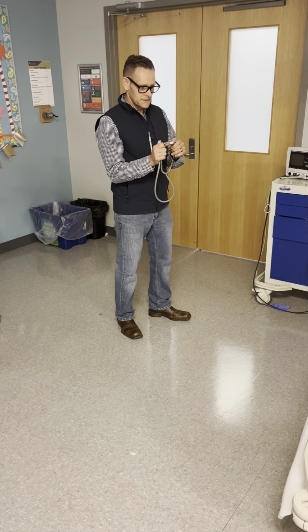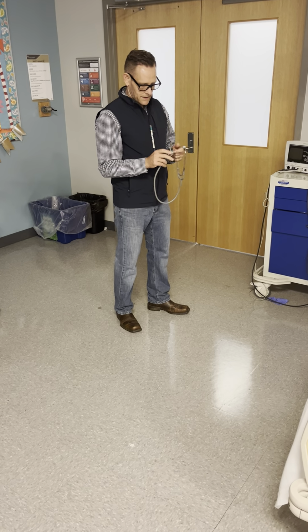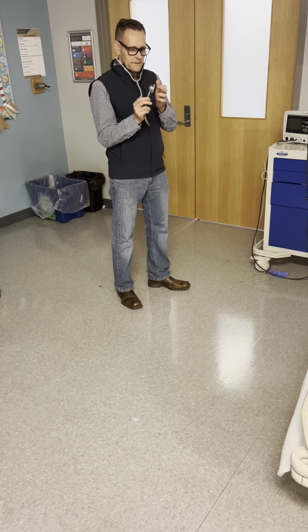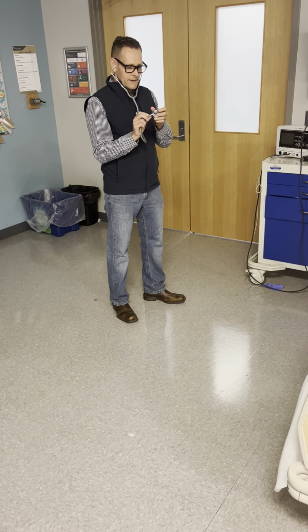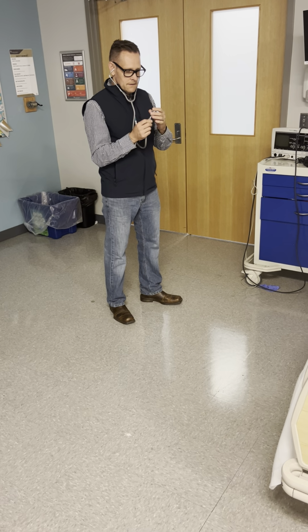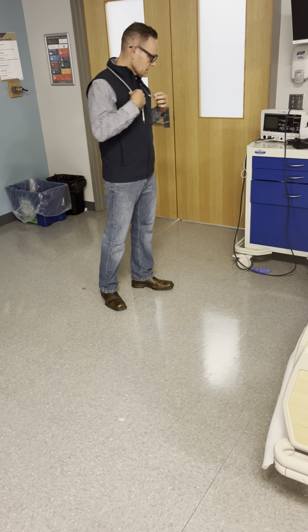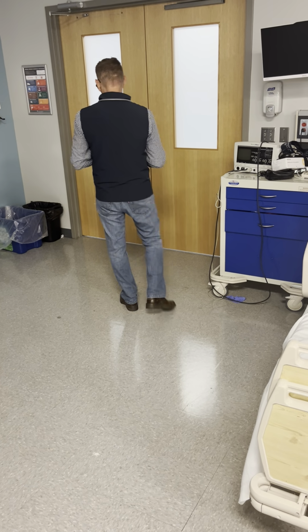So remember, these point like that. And you always want to put these in your ear and kind of tap the bell to make sure it's open on the right end. Otherwise, you turn it. Okay. All right.